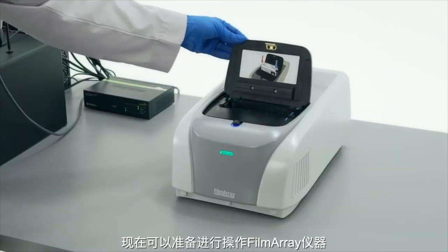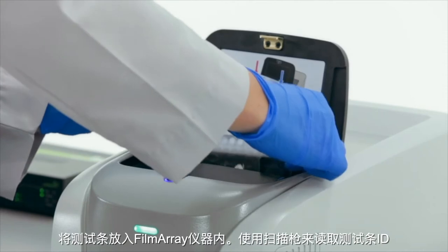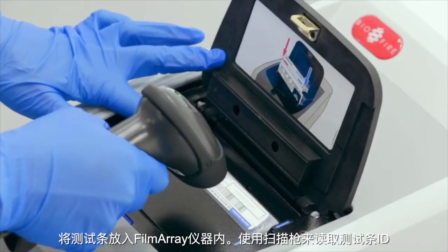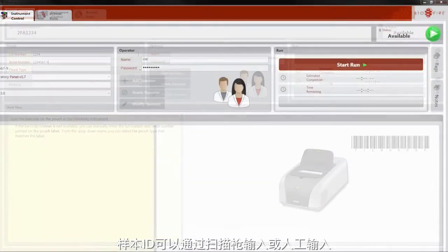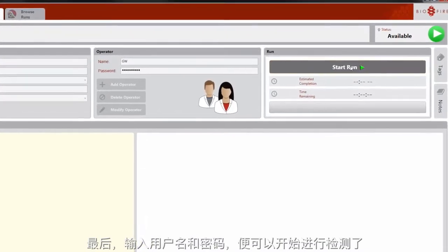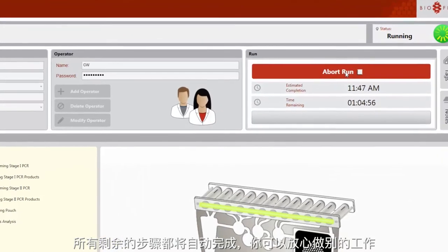The FilmArray instrument is now ready to set up. The FilmArray pouch is loaded into the FilmArray instrument and a barcode reader is used to enter the pouch ID. The sample ID can also be scanned with the barcode reader or entered manually. Last, the user ID and password are entered and then the run is started. You are free to walk away since all remaining steps are completely automated.